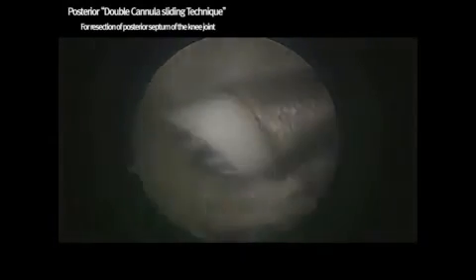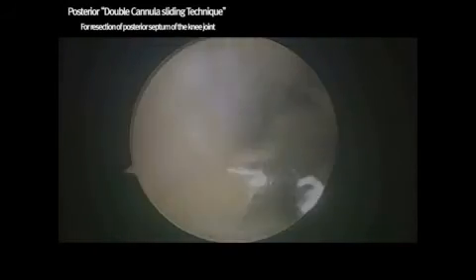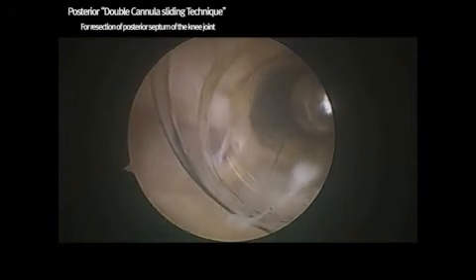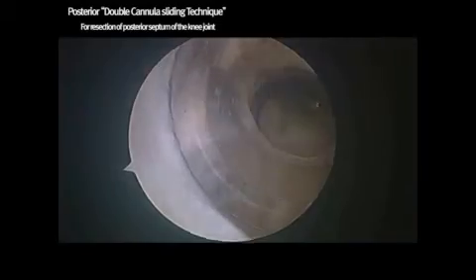All the courses were controlled safely and stably under direct visualization. The arthroscope and instrument were inserted respectively in the posterior medial and posterior lateral portals to achieve direct posterior-posterior triangulation.